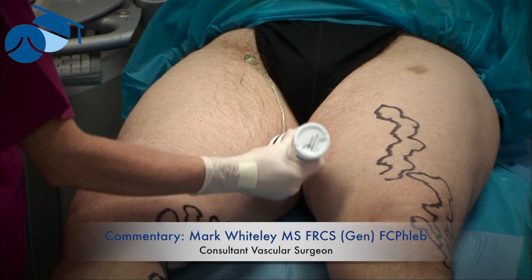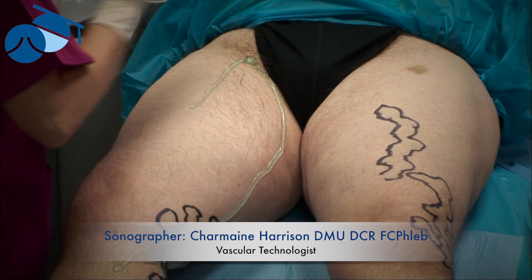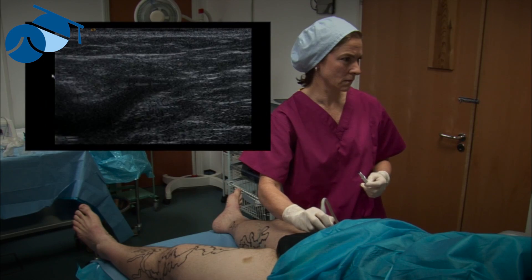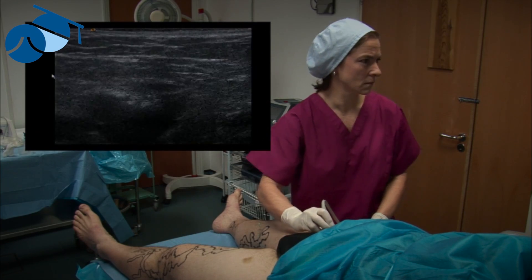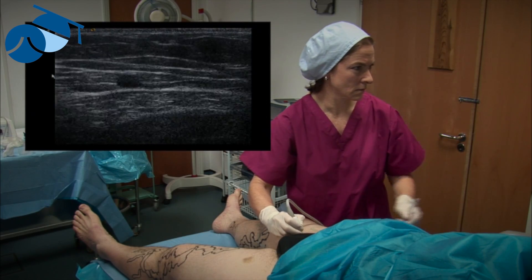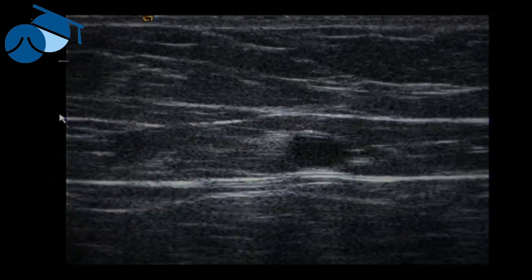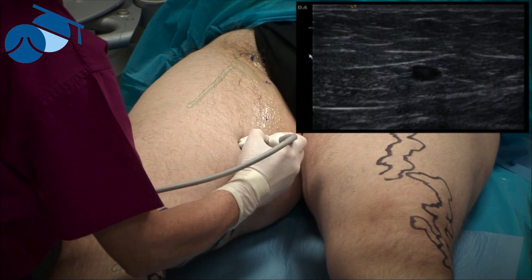We are marking the great saphenous vein for endovenous surgery — in this case we're going to use endovenous laser. We're also marking the anterior accessory saphenous vein, that used to be called the lateral thigh vein. The vascular technologist is looking at the sapheno-femoral junction and putting a mark in place. We need these marks to find the vein quickly, to track the endovenous device, and to ensure tumescence points are covered. Each of these points is where we'll place a bleb of local anesthetic to put tumescence around the great saphenous vein.